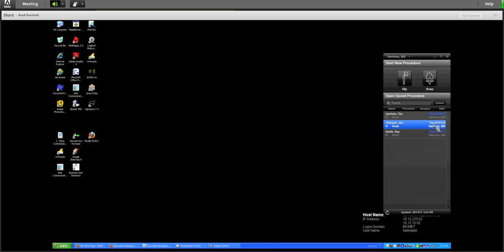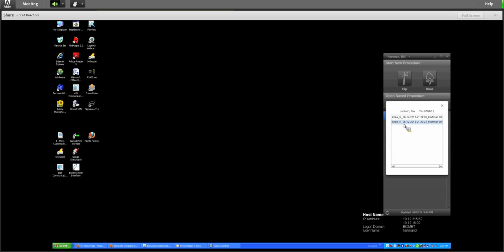Sure. So I just saved that case. Chris just came in and gave me a question, so let's go back and look at that. So here is the Tim Jerrison, the case that we just did. And now when I double click this, you'll notice there's two entries. It's in chronological order, and you would always know what was the latest change to this system.